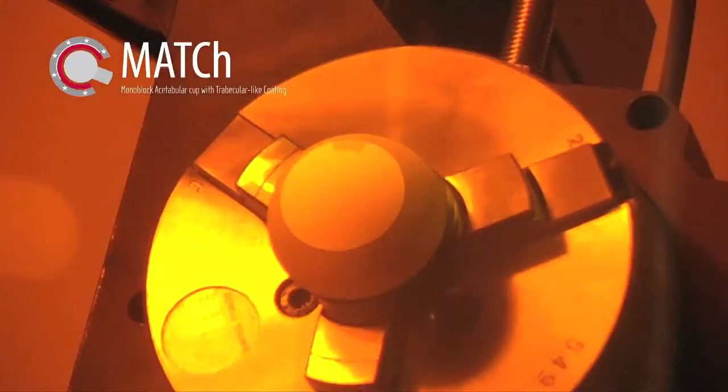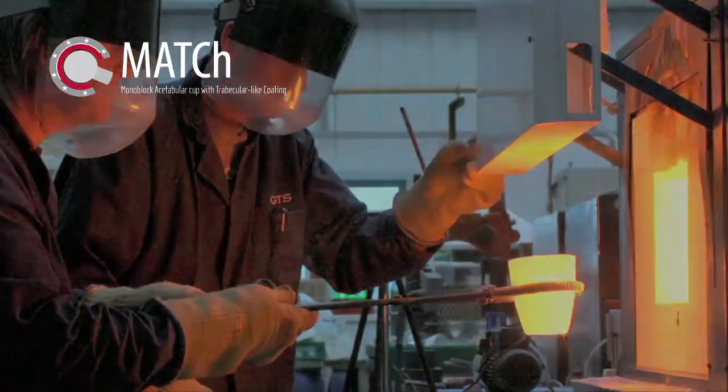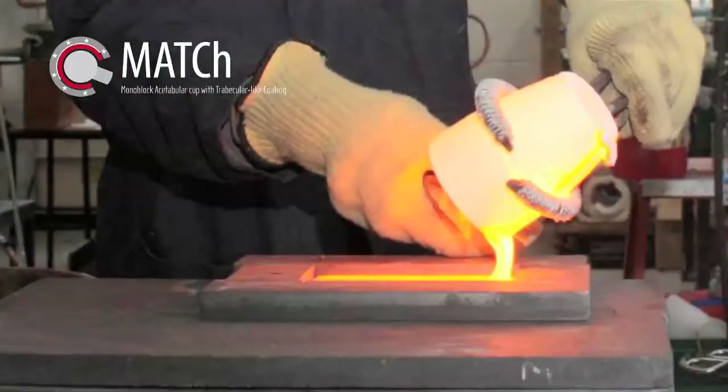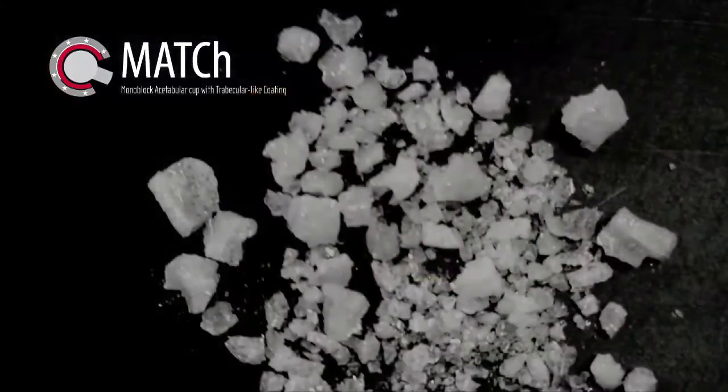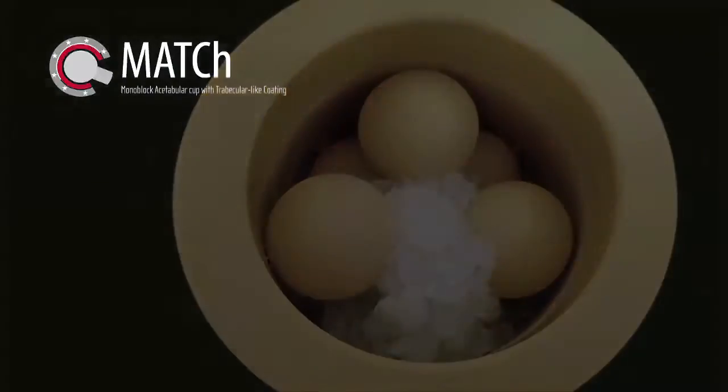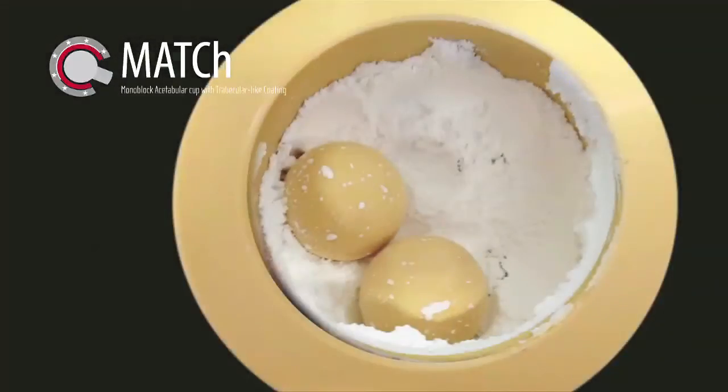To achieve the best coating, different glass compositions are studied by considering the thermal expansion coefficient and their biocompatibility. From the selected glass composition, a homogeneous mixed glass powder is obtained with the required particle size for coating.